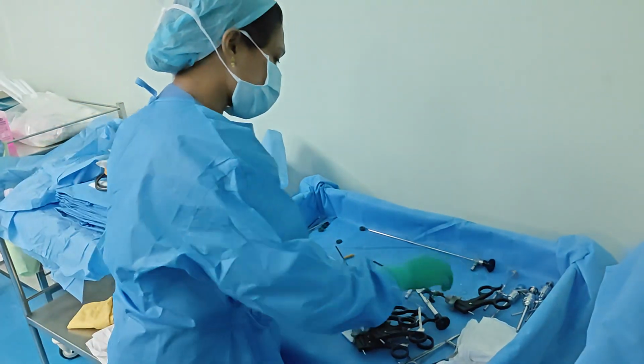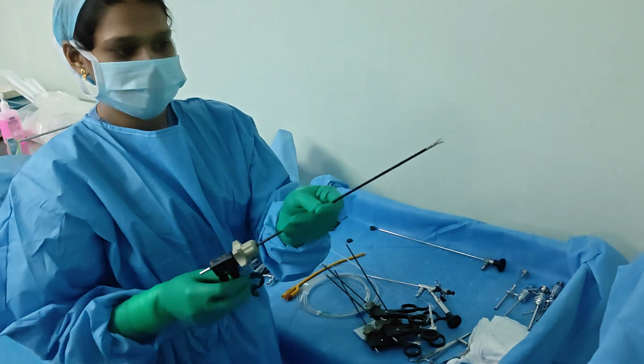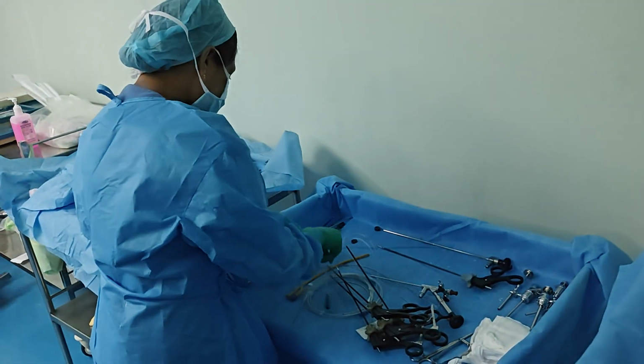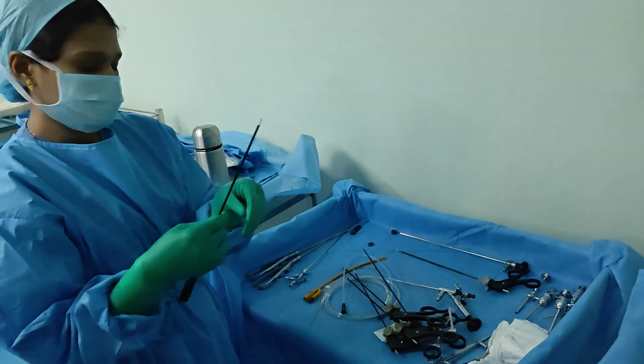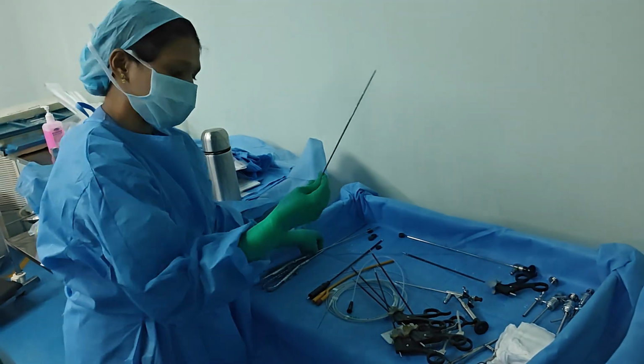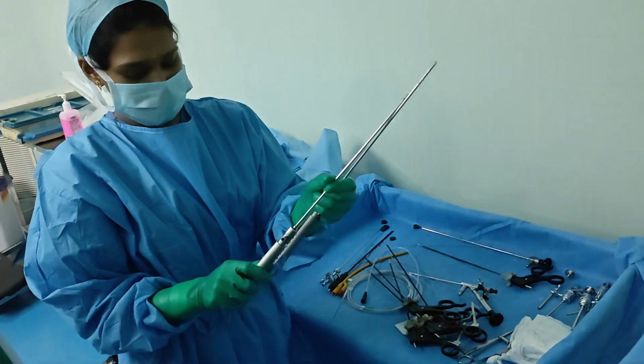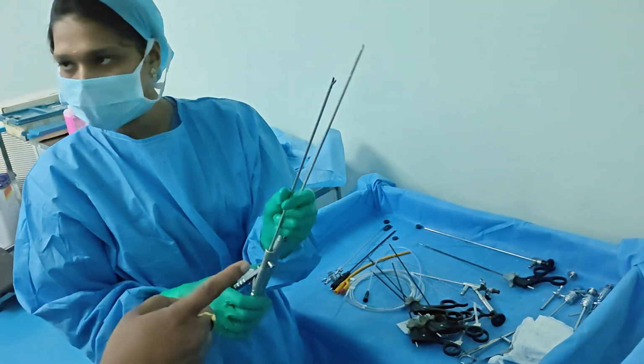Needle holders, then scissors, curved scissors for cutting the ureter. Then what else do we have? Then a hook, and suctioning. There are 2 needle holders, one is straight and one is curved.